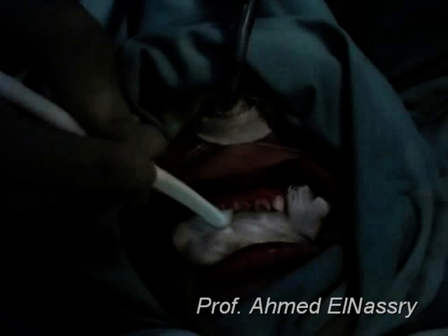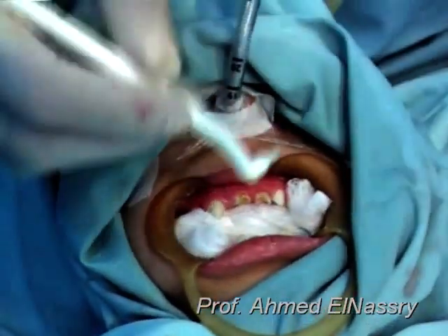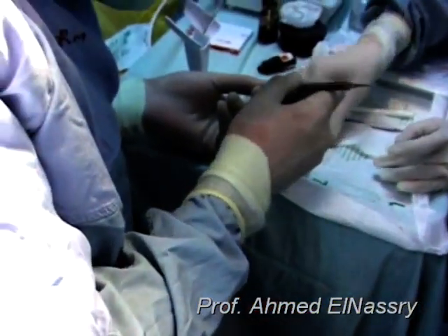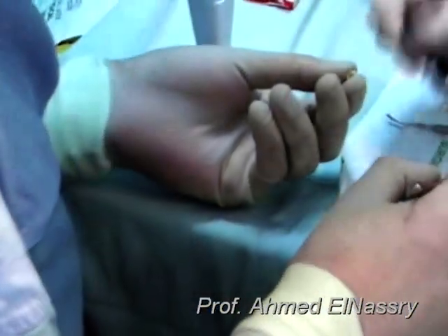After etching the teeth surface, apply the bond and load the celluloid crown with composite.